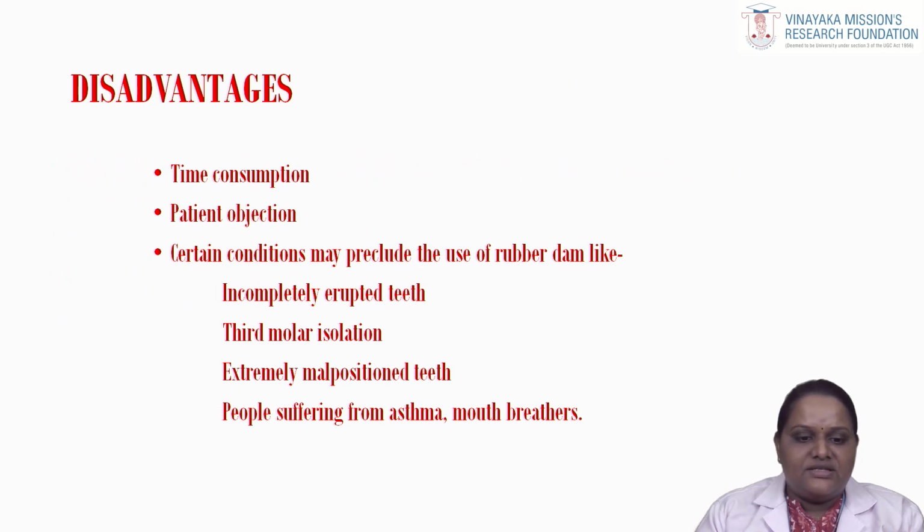What are the disadvantages? It's mainly time consuming, patient objection, and certain conditions may preclude the use of rubber dam, like incompletely erupted teeth, third molar isolation, extremely malpositioned teeth, people suffering from asthma or mouth breathers.